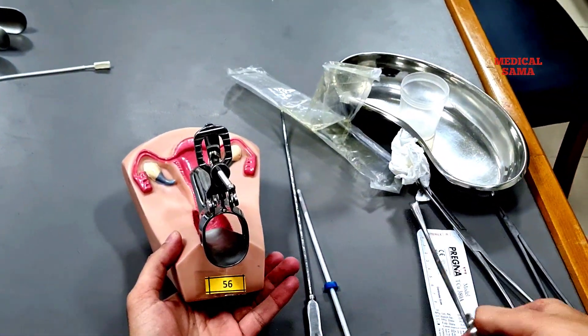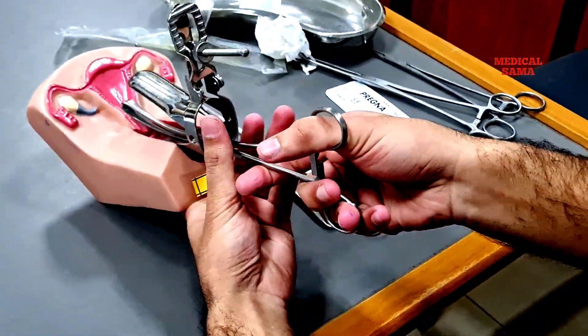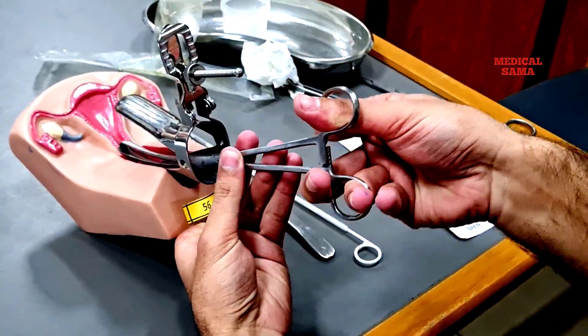Now hold the anterior lip of the external os with the help of the tenaculum and apply traction to align the cervical canal and uterus in the same plane.